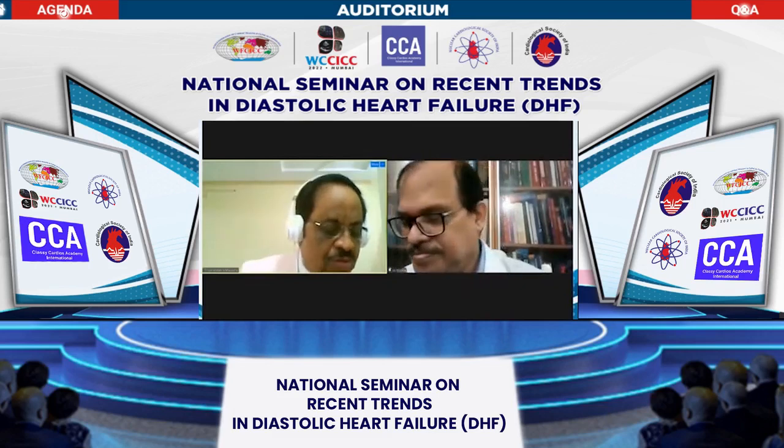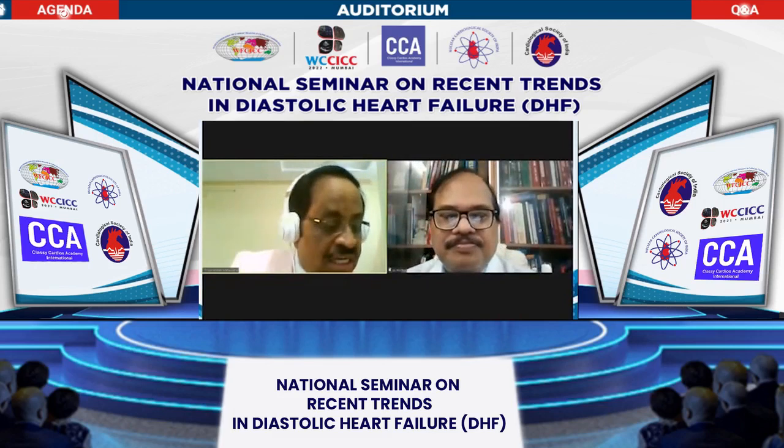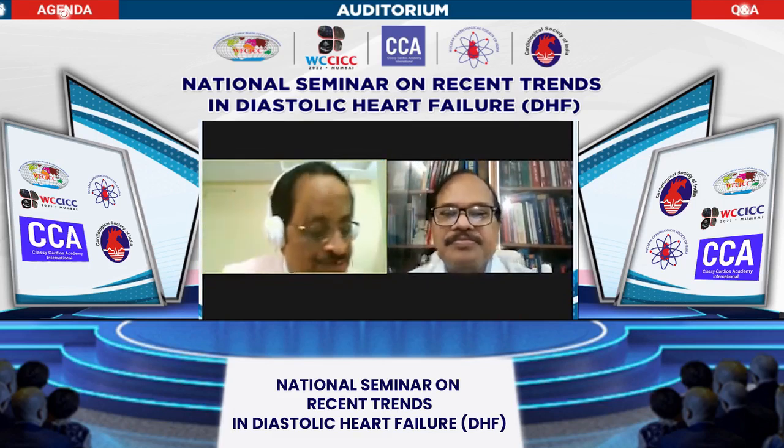So now we'll move to the next important session, diagnosis: imaging in diastolic heart failure. This is one of the mainstays of this diastolic heart failure seminar.